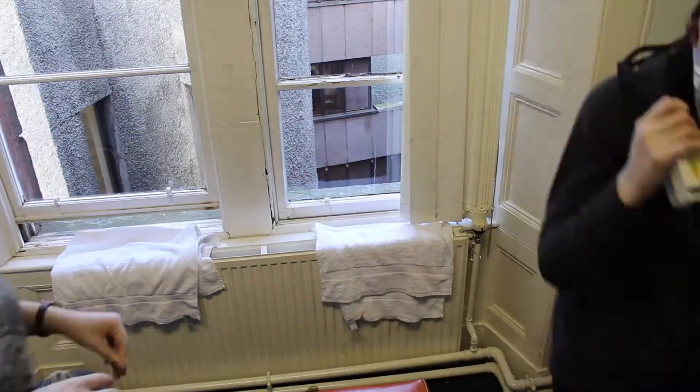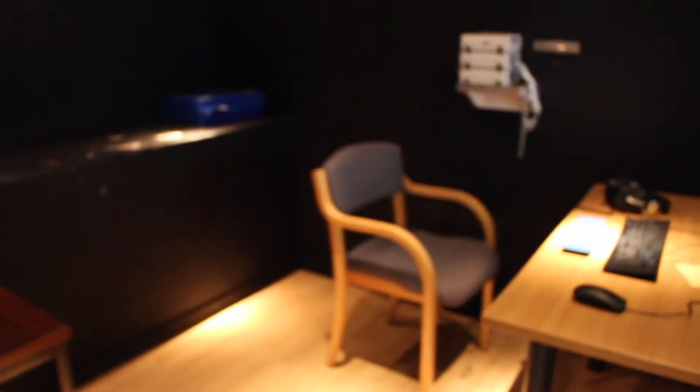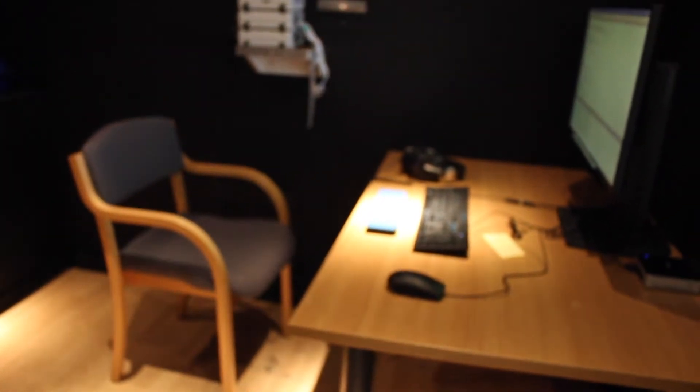You should check one more time whether the participant needs anything before being seated. When they are ready, seat them in front of the Stim PC monitor.